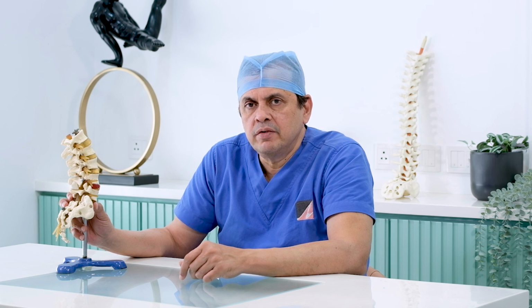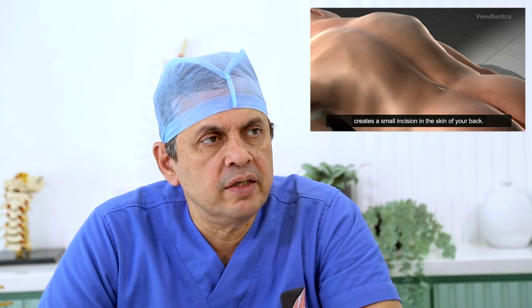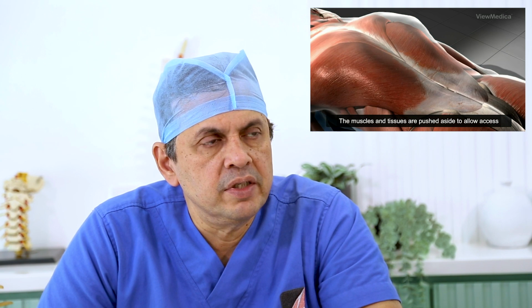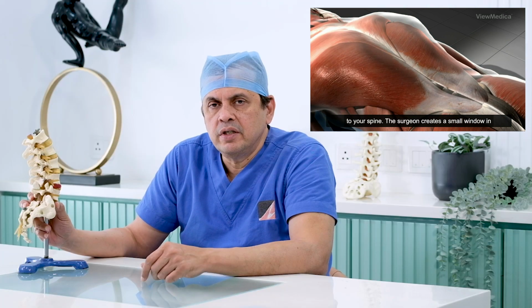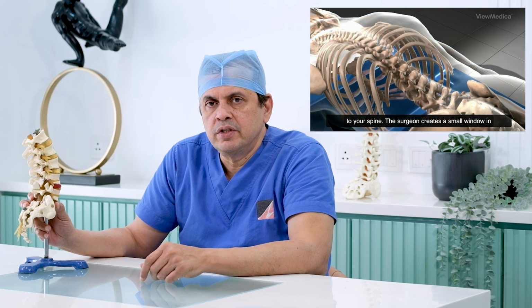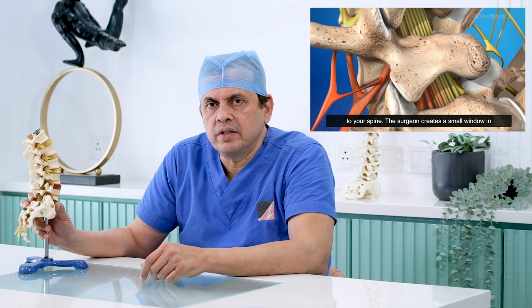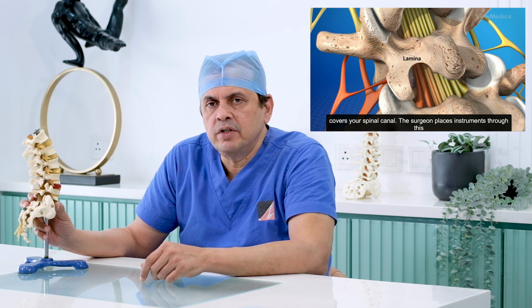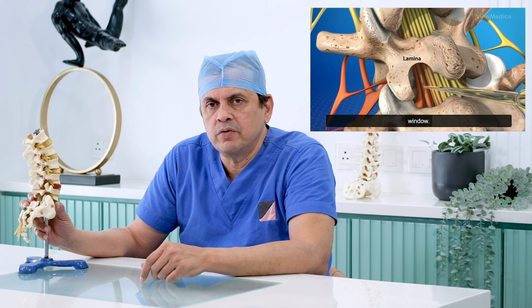During this time, we decide for a procedure called micro-lumbar discectomy or endoscopic discectomy after doing proper investigations. The aim of the procedure is to remove the disc material which has come out of its position and is pressing the nerve. This is done with an endoscope where the person is lying prone under local anesthesia, or with a micro-lumbar discectomy in which we use a high-power microscope to remove the disc.